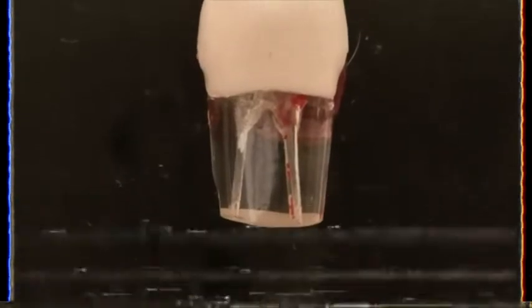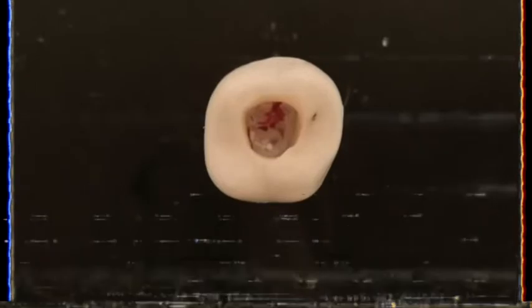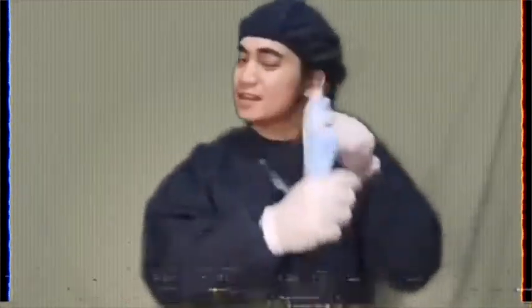Root canal therapy may look like a simple procedure, but it may be very complex depending on each root configuration of each tooth. So I hope you enjoyed watching and learning with us about root canal therapy. Actually, the procedure isn't even over yet. Stay tuned as we will be posting more videos regarding root canal therapy.